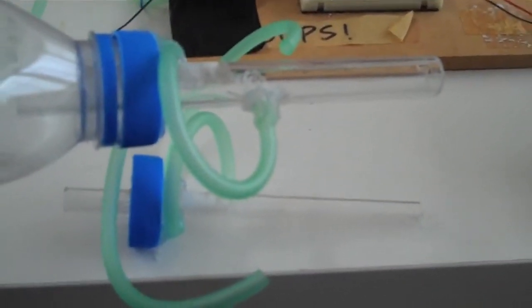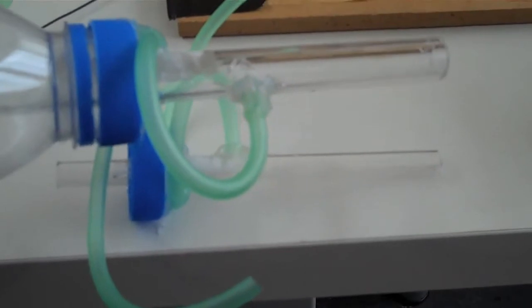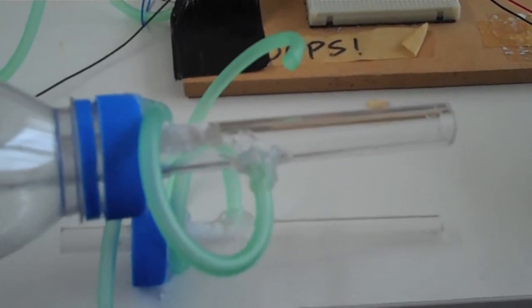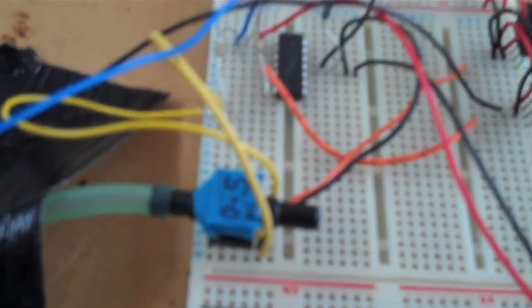You can see here the two different bore size end caps. I made a series of end caps here. Basically, the more restricted the bore size of the exhaust is, the higher the pressure differential between input and output. Obviously it's a juggling act, because the smaller the bore size, the more difficult it is to breathe. But with the one I've currently got on here, you can satisfactorily breathe out very quickly and still give a decent pressure differential. We're currently using a 0 to 0.5 psi pressure differential sensor, which is about the smallest I can get. It's about £14.